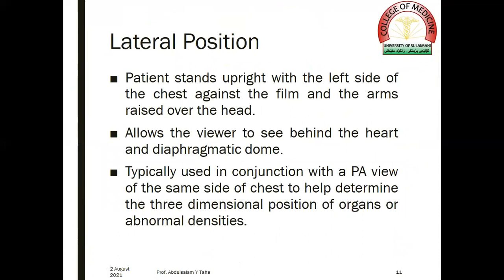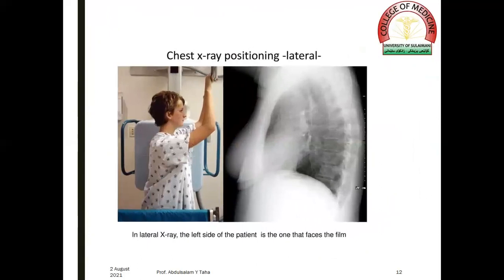In the lateral position, the patient stands upright with the left side of the chest against the film and the arms raised over the head. The lateral view allows the viewer to see the region behind the heart and diaphragmatic dome. It is typically used in conjunction with a PA view to help determine the three-dimensional position of organs or abnormal densities. The resultant radiograph is the left lateral chest radiograph.